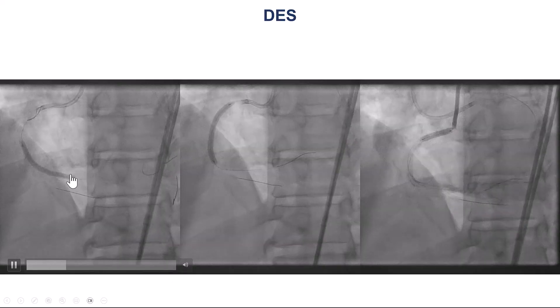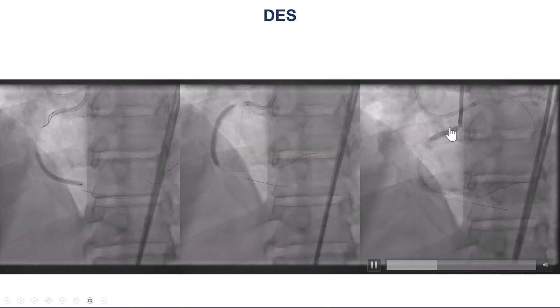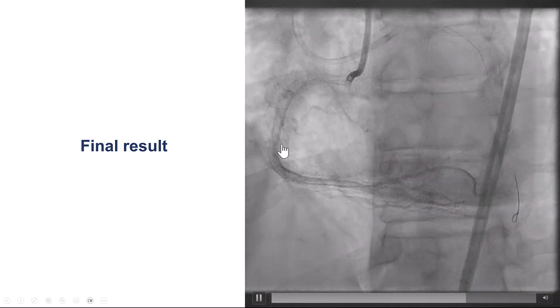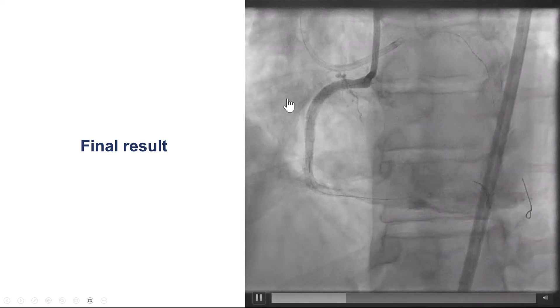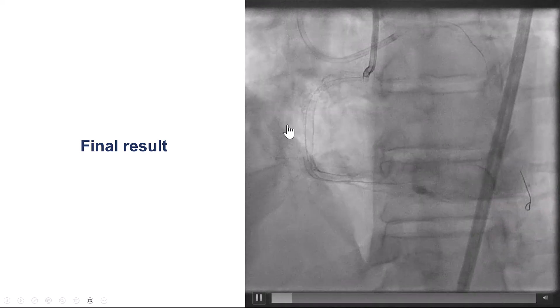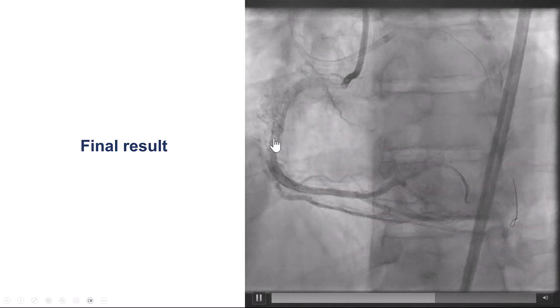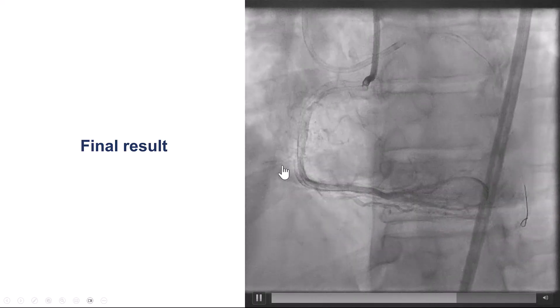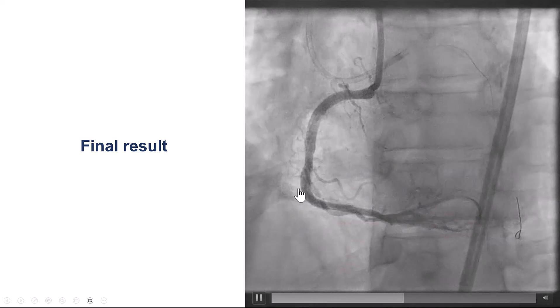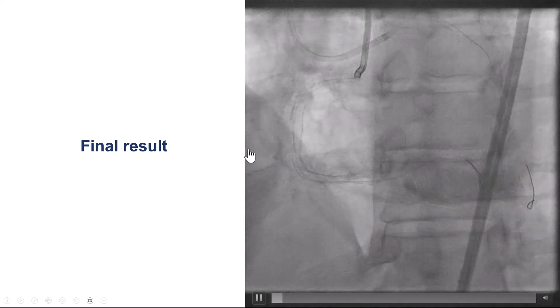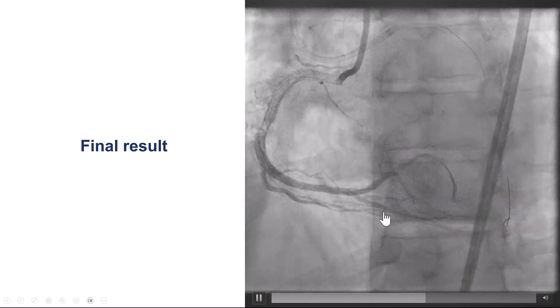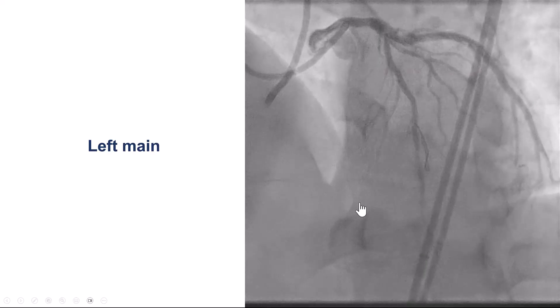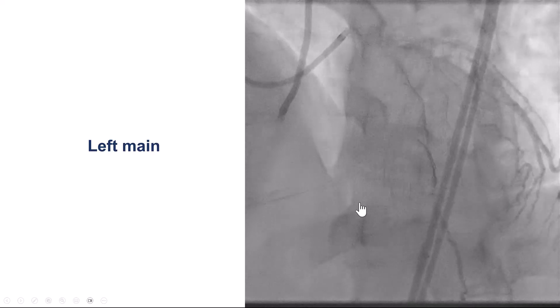We placed three drug-eluting stents from the distal RCA all the way to the proximal right coronary, providing a nice result with TIMI-3 flow. Interestingly, we still see the network of ipsilateral bridging collaterals, but fortunately no perforation was observed, and there is good filling distally. The acute marginal branches remained patent, which is important because loss of these branches can cause right ventricular failure and, in some cases, cardiogenic shock. We confirmed the left side had no injury.